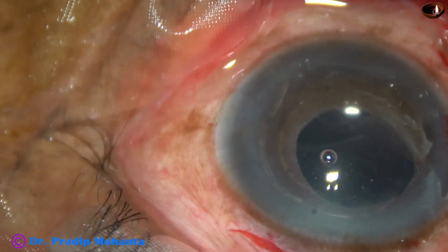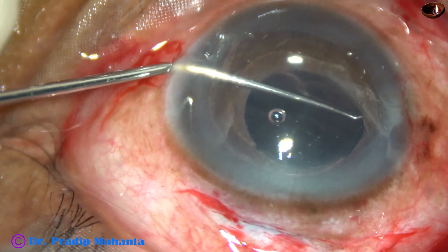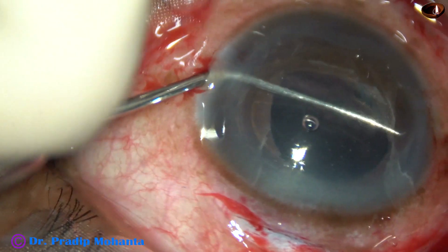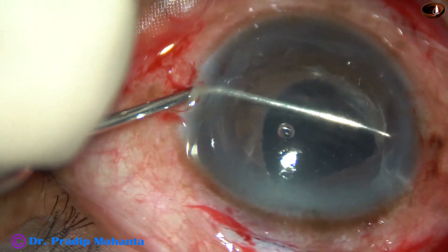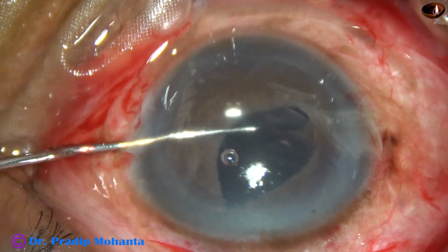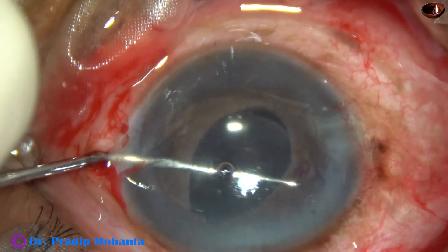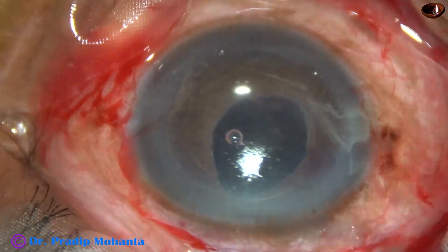Since my plan is to implant an iris claw lens, these two stab incisions are 180 degrees away. Now here I find some adhesions — some iris tissue or vitreous strands. I have just detached them. And now I am going to mobilize the haptics.